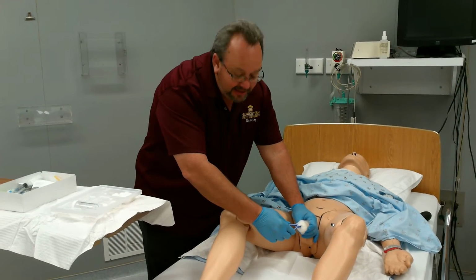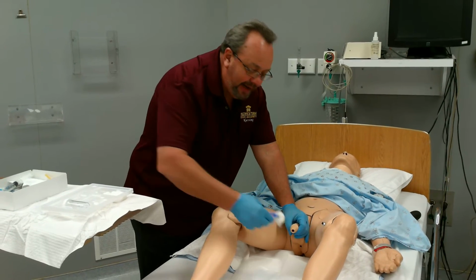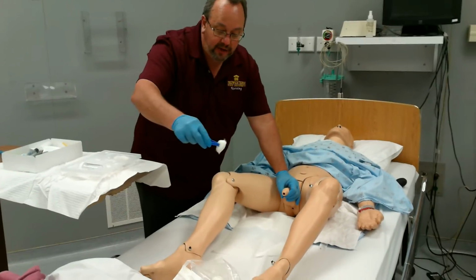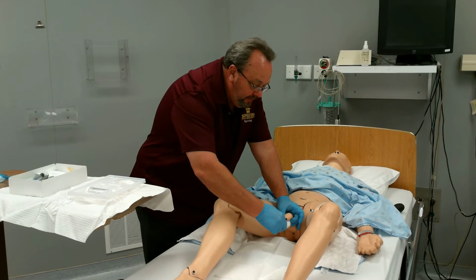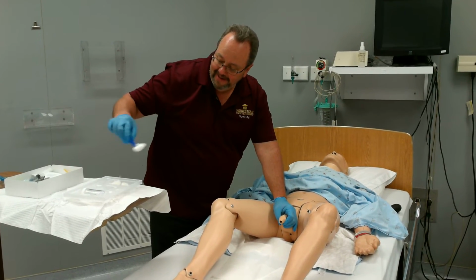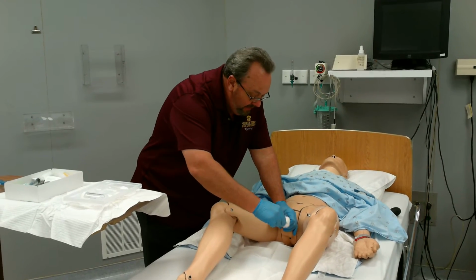I will start at the meatus, the opening of the penis, and work my way down spirally along the glans to the bottom of the glans. The glans is the head of the penis. So I clean all the way from top to bottom, throw that one into that trash can that I put, grab me another one, start here, work my way down again, and into the trash. Another one, and then trash. And you will do all 5 of these.